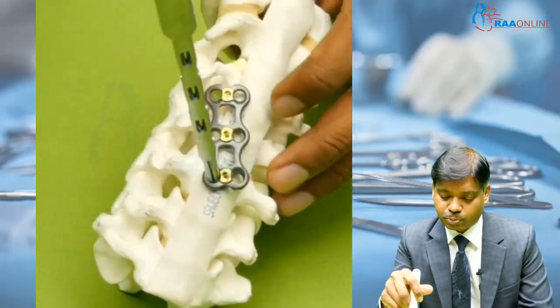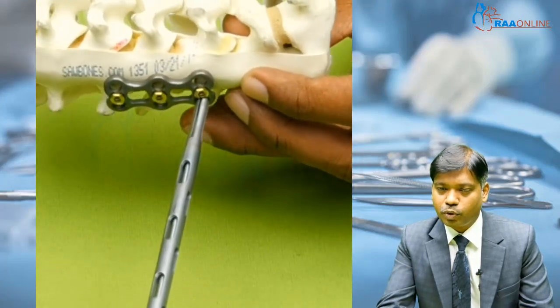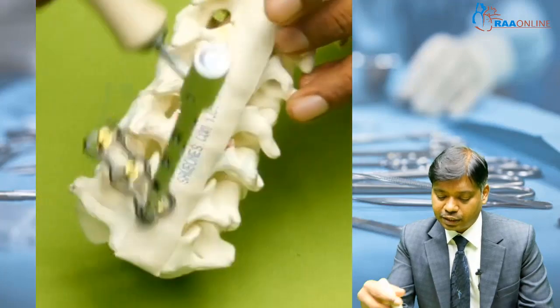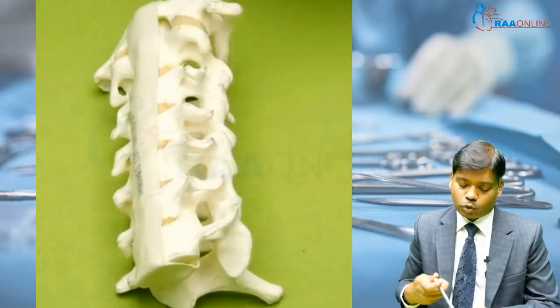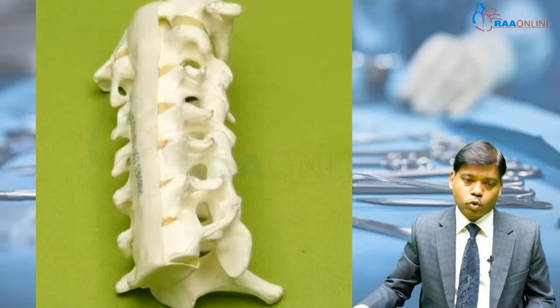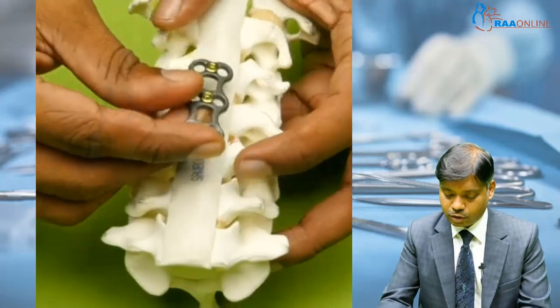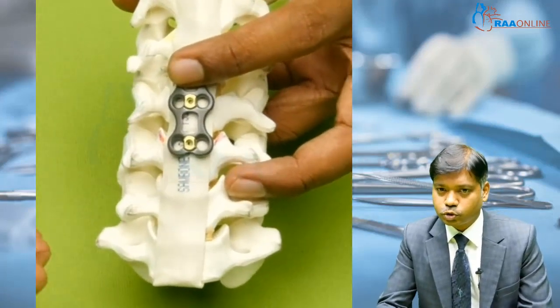Once the plate is placed, it should not be over the disc. That is very important. You have to confirm the position of the plate, that it is not over the disc and it is over the vertebra. Once the plate is placed, then you have something called the screws. So this plate is placed and then you use screws.